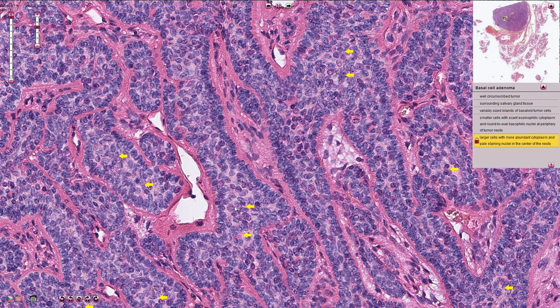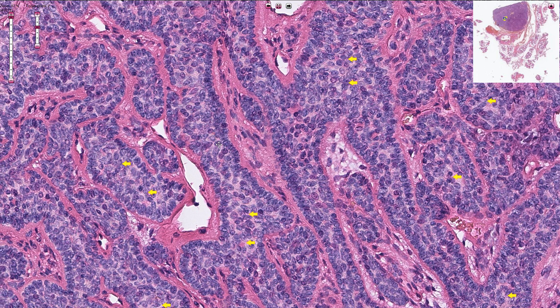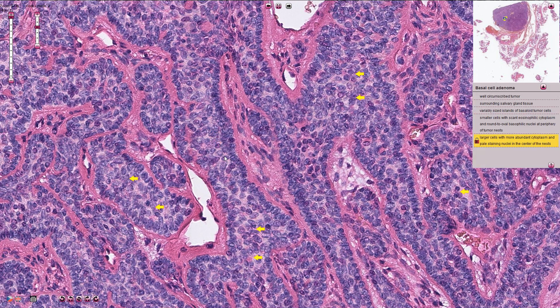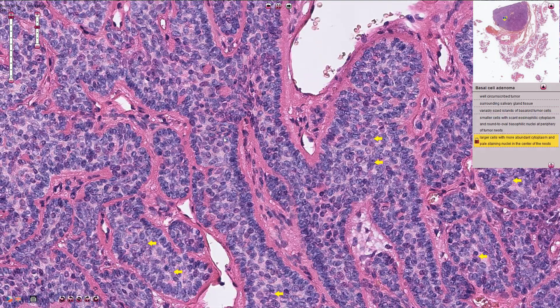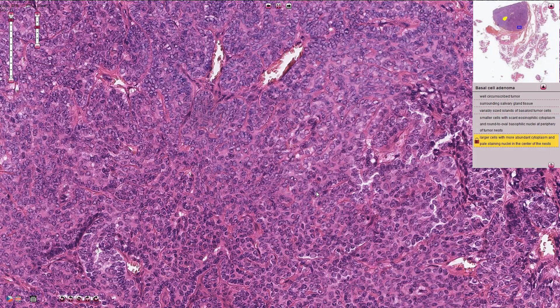Both of these cells have a basaloid appearance. There are no cytomorphological atypia. Mitotic figures are quite rare and we shouldn't find atypical mitosis.